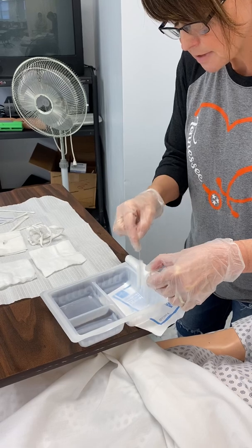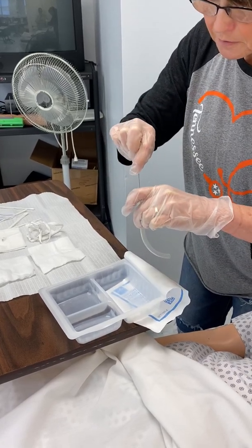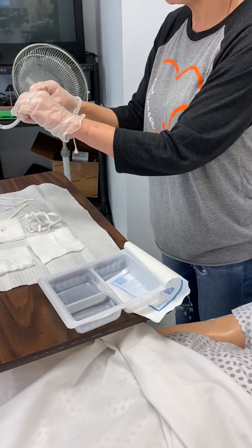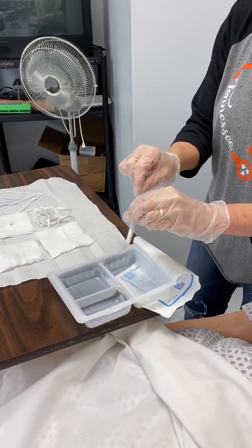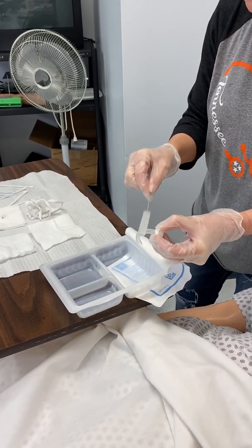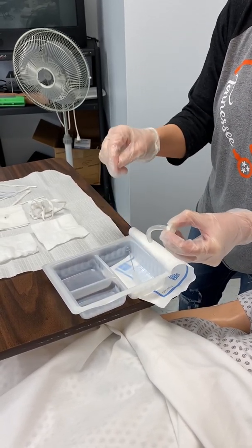I'm going to clean the outside of it. I'm going to clean the inside of it. And I want to be sure that I'm not cleaning over my sterile field. You want to clean over here. You don't reach over your sterile field. I'm going to clean, clean, clean, clean, clean, clean. I'm just going to leave that in there.